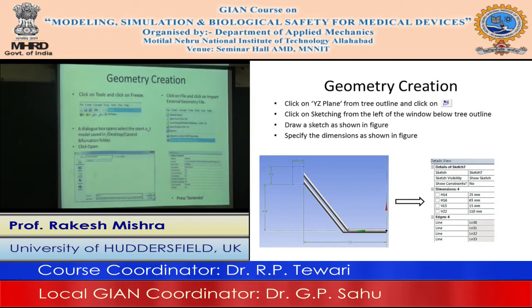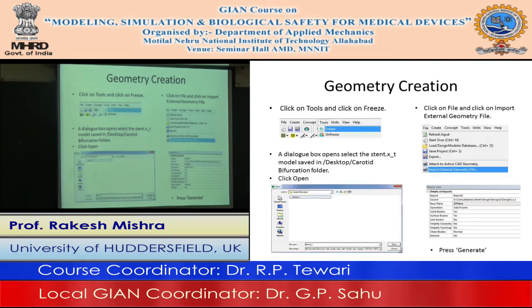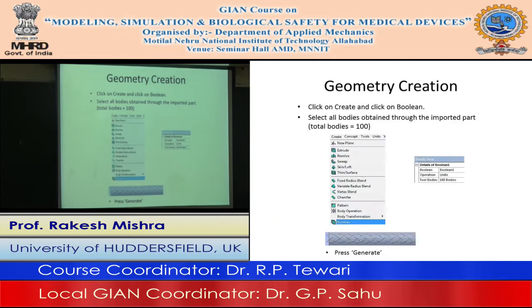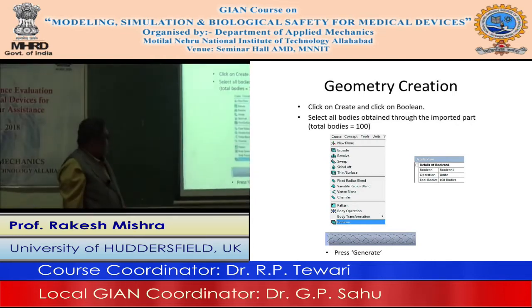ZX plane is the base plane, and it has been created that if you import it like this and generate, it will come somewhere in your bigger artery. Okay, so it will be coming there in the bigger artery. You will import it. Now I need to place it at a proper point. So what I have to do is I have to move it and place at the required point. So this is simple step. I will give you the geometry, just copy it, and then you can place it at a proper point.